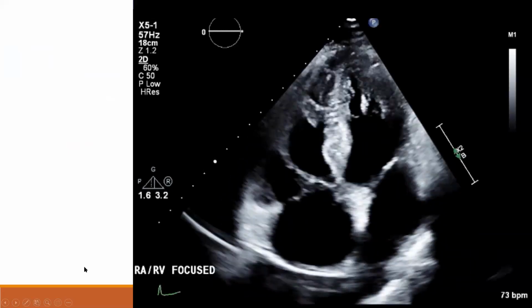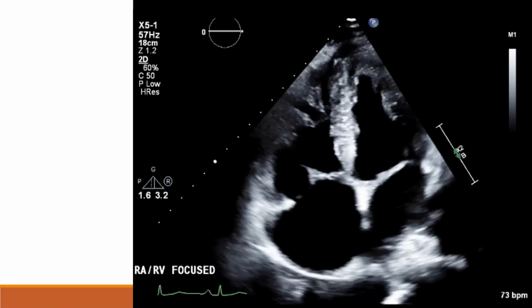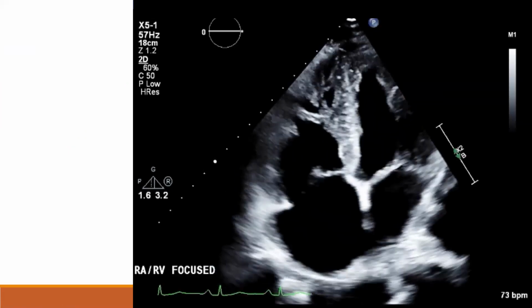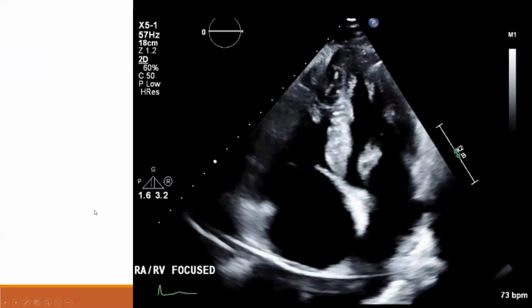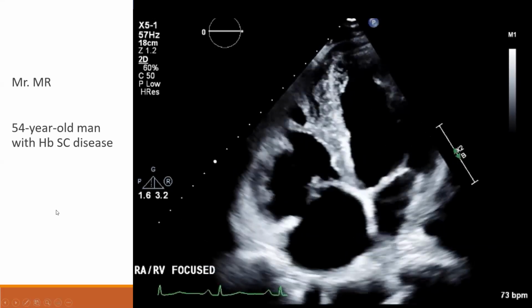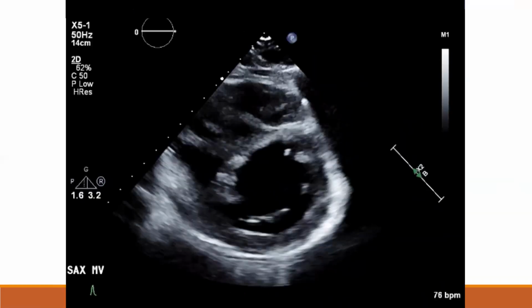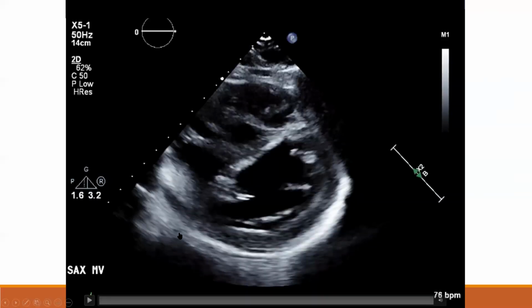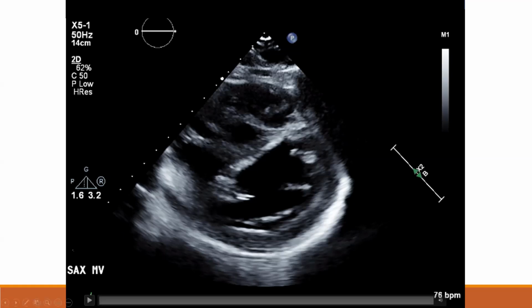So here's another patient. This patient has, as we saw in our previous case, a dilated right ventricle. Though it looks like the RV systolic function is relatively preserved, and the RV free wall tends to move a little better than our patient with the PE. This is a 54-year-old man with hemoglobin SC disease, which is a variety of sickle cell anemia. Sorry about the video here, but this patient also has flattening of the interventricular septum, which is characteristic of RV volume overload.